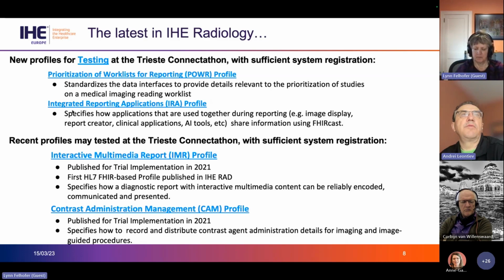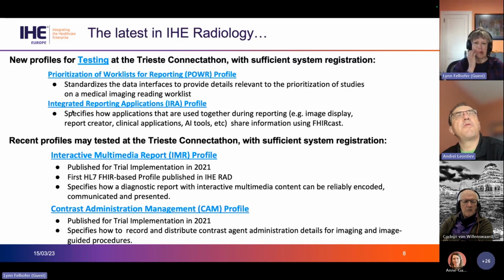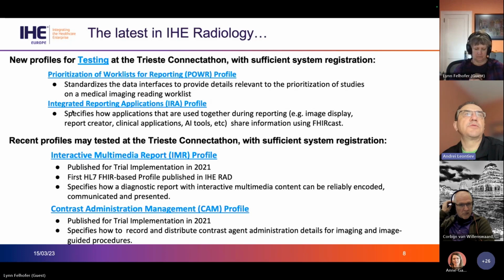So this profile, again, is a building stone in creating the full picture. Our intent with the Imaging Diagnostic Report profile would be that the full encoding concept for the diagnostic report will include what was first introduced by the multimedia profile, completing the picture.